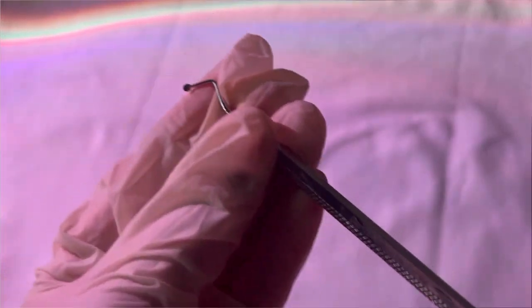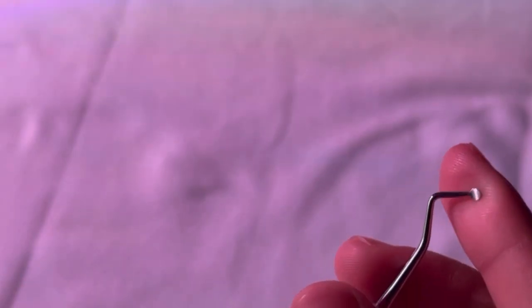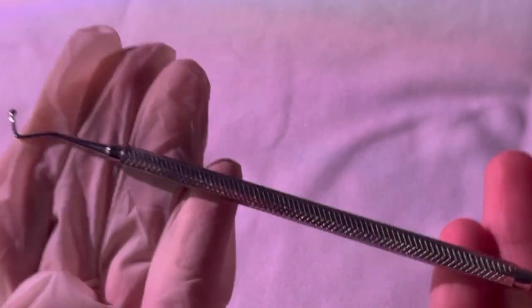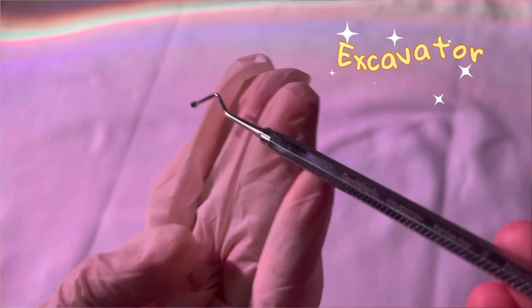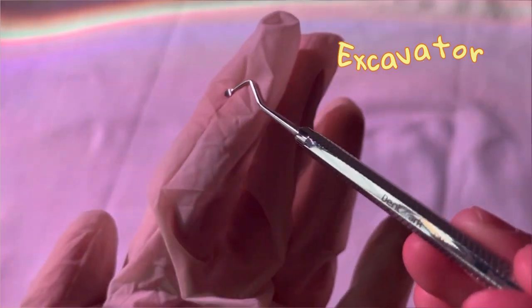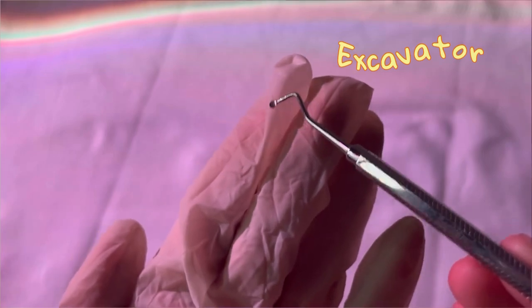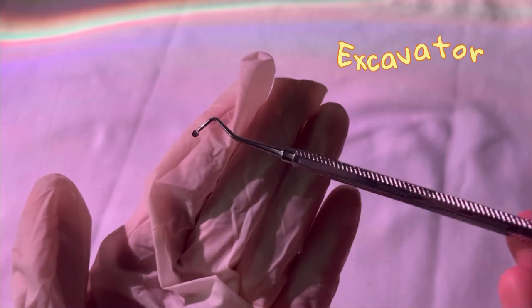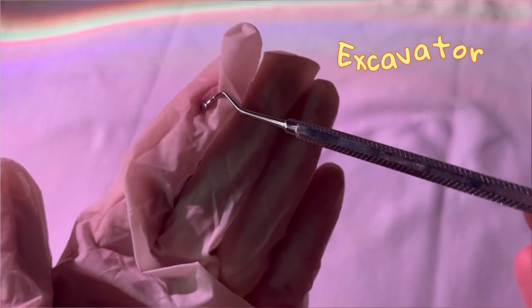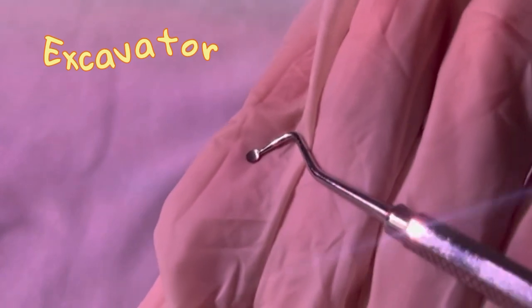Can you see this instrument? One side is shaped like a spoon and the other side is also shaped like a spoon. This is called an excavator. Because of the spoon shape, it is very easy to remove any decay, debris, or soft dentin. It is also used for detecting caries, cavity preparation, and removal of dentin.